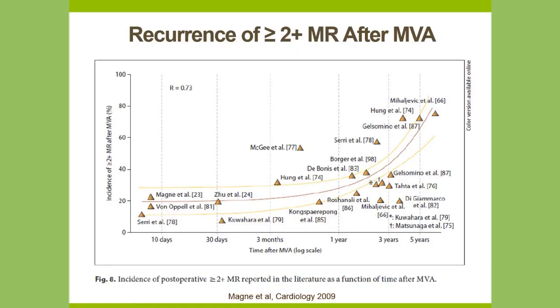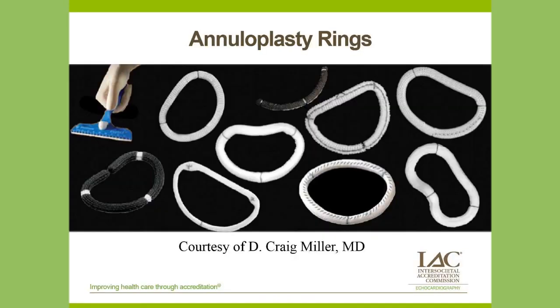Now, traditionally, the surgeons have shown this slide, and they've said, well, if you do a rigid ring annuloplasty, you have a low recurrence rate of MR out to 3 years, but if you use a flexible band or an incomplete band, you have a high recurrence rate. And this study was shown a lot. There are all kinds of rings that you can put on. This is the good guys and the bad guys.